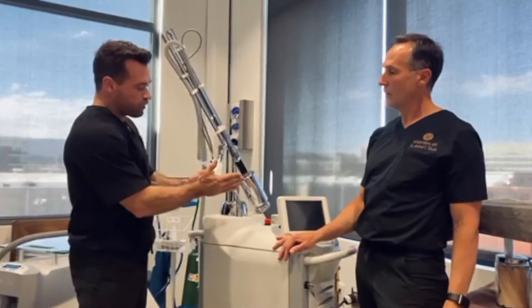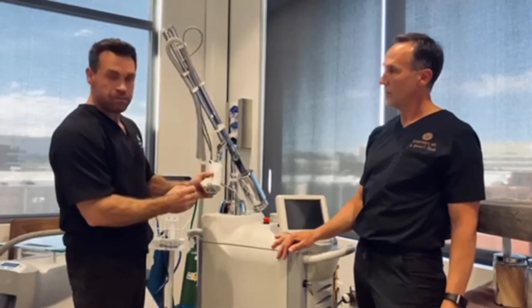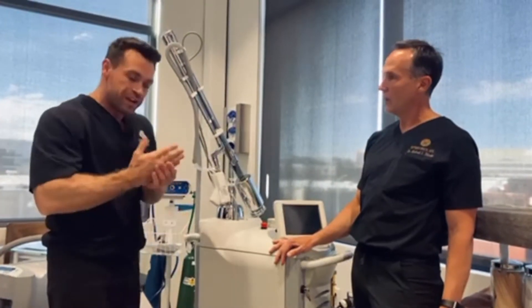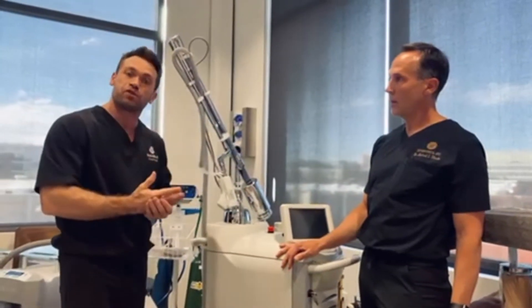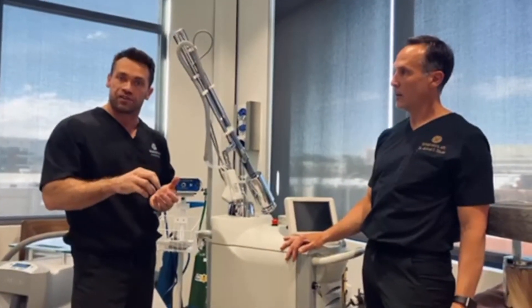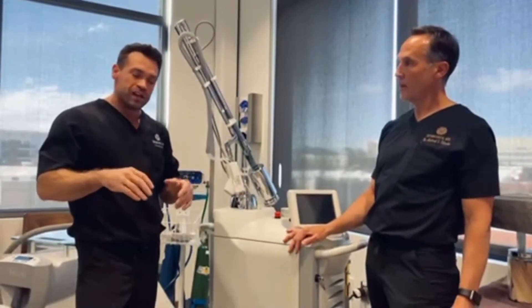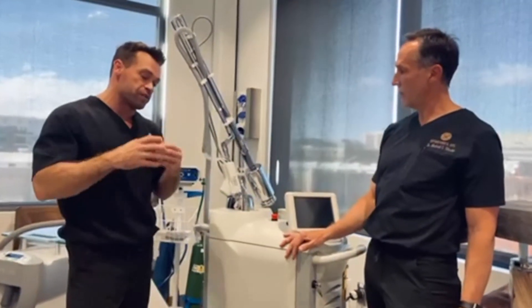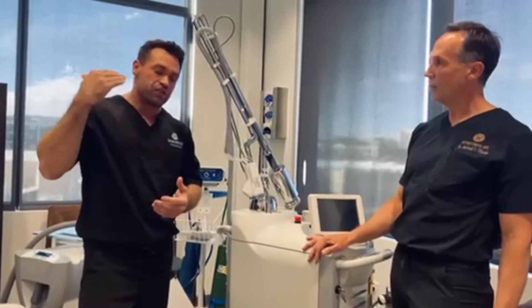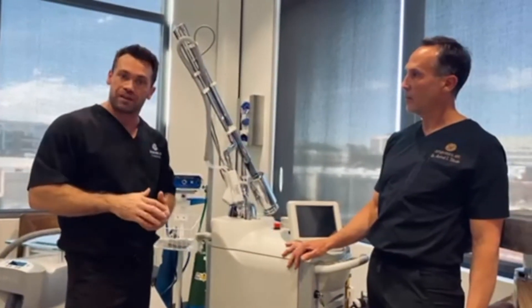As you roll it across the patient's skin — this doesn't have the little tip on it — it actually will instantly detect the temperature of the skin and adjust the power of the laser. That's never been done before. If you have someone at room temperature or with a Zimmer chiller on the skin, you're not getting a consistent treatment because the skin temperature is changing up and down.